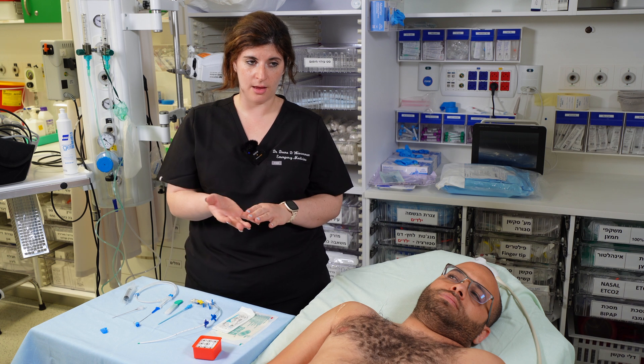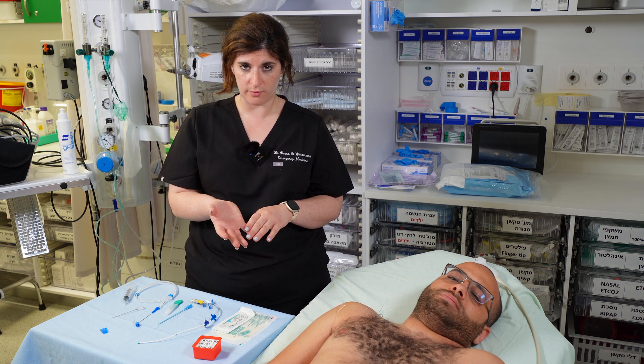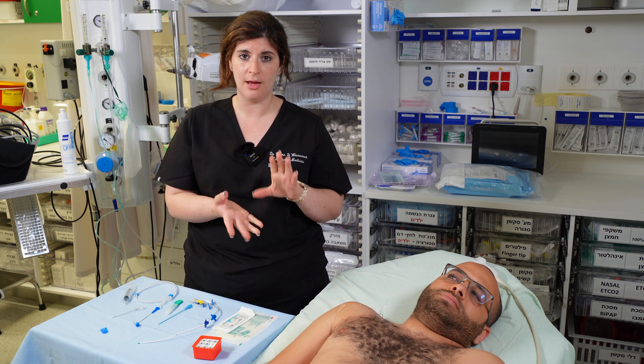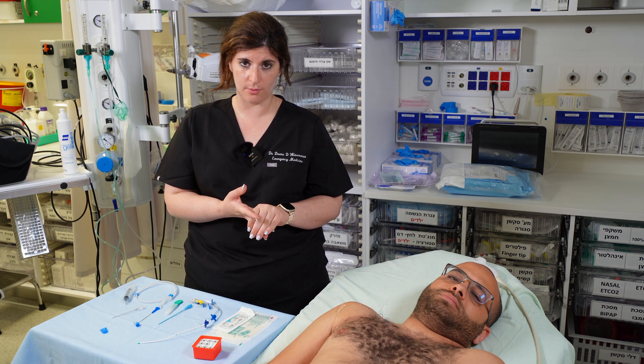After all that, use ultrasound to confirm you don't have a new pneumothorax, check blood gases to confirm you're in the vein and not the artery, and get a chest X-ray to confirm the line is in the right place.